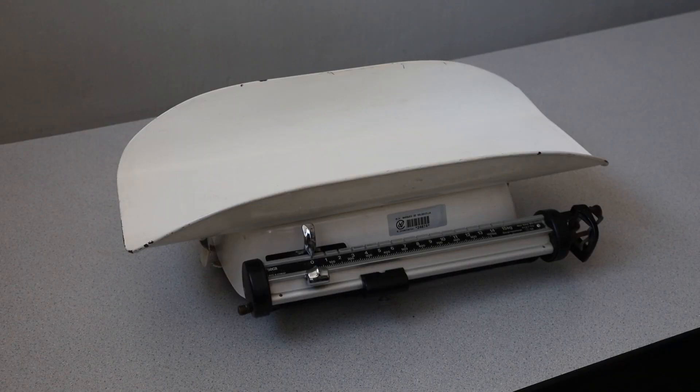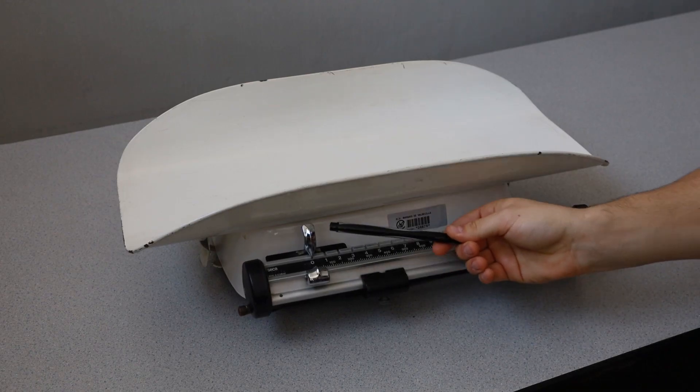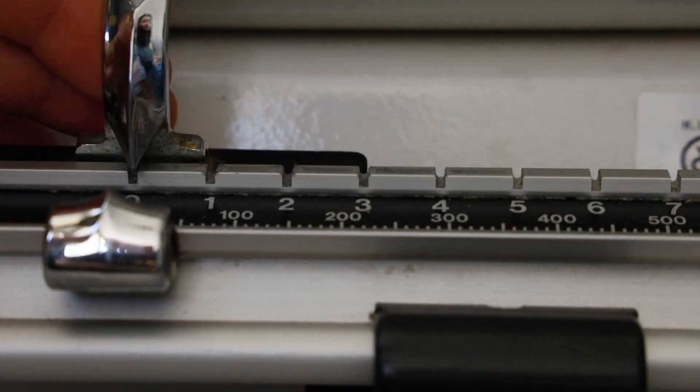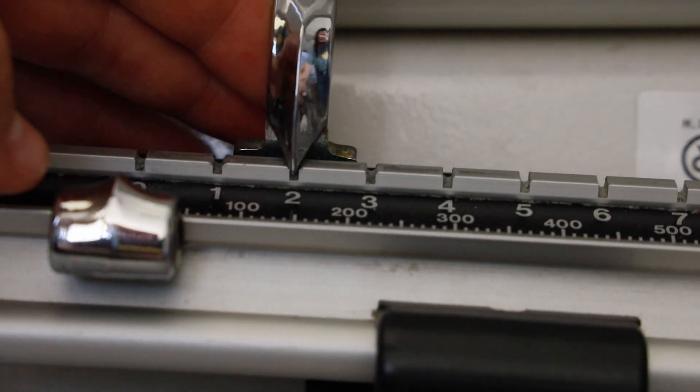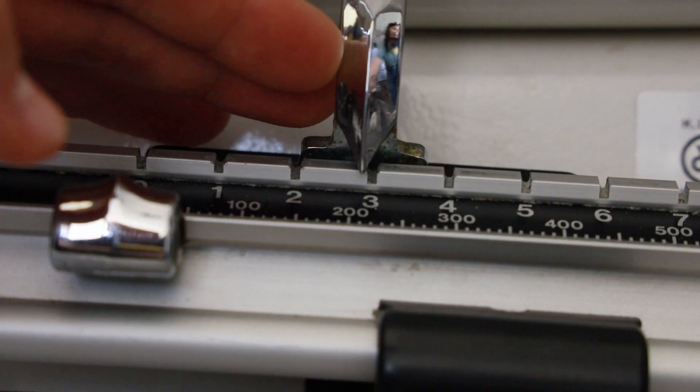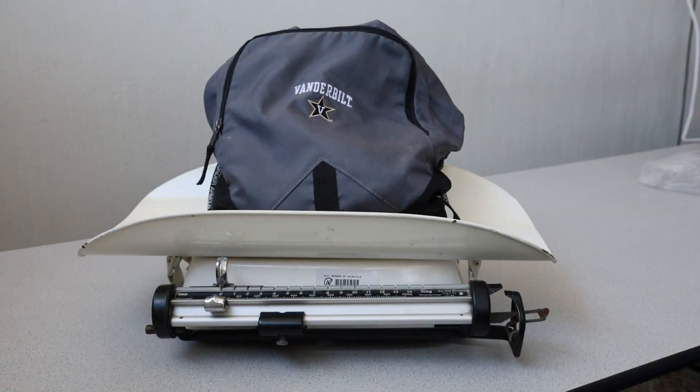We will now demonstrate how to properly determine the weight of an unknown object. To perform a weighing procedure, two weights are used to level the beam balance: the small weight and the large weight. The large weight can be slid across the metal railing and held in place at discrete locations along the rail by slots in the railing.